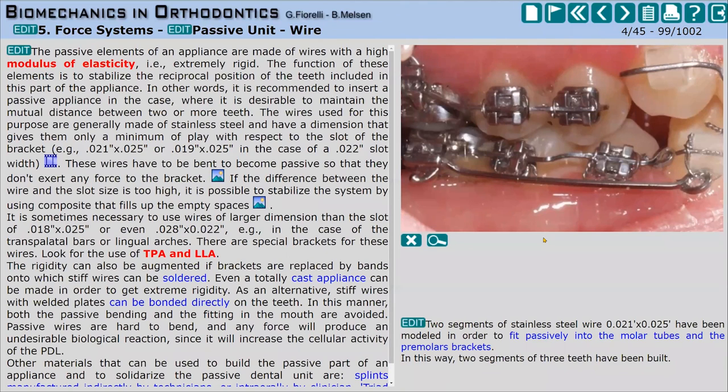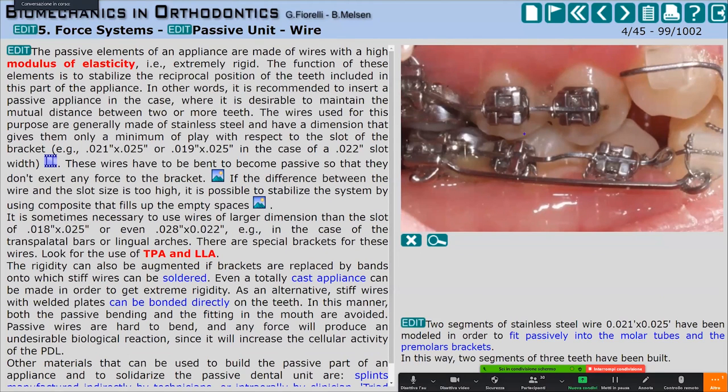As you see here, we have the beginning of the treatment, and these teeth are with a very good occlusion. So you see there is a great intercuspation between these teeth. And you might imagine that we have to start to move the anterior teeth. Here you see a cantilever which is making an intrusion. There's another wire, we don't know what it's doing, maybe it's aligning the anterior teeth.